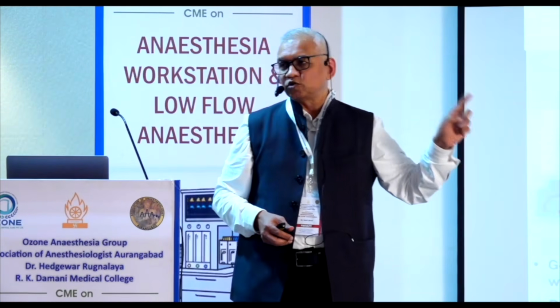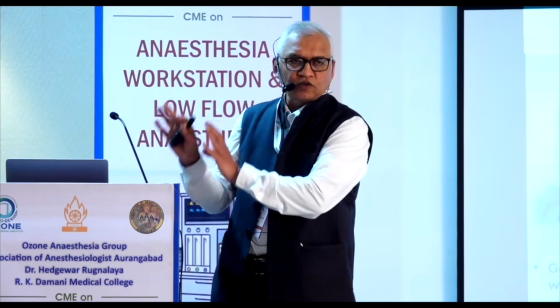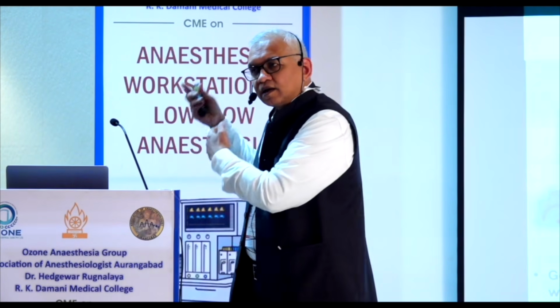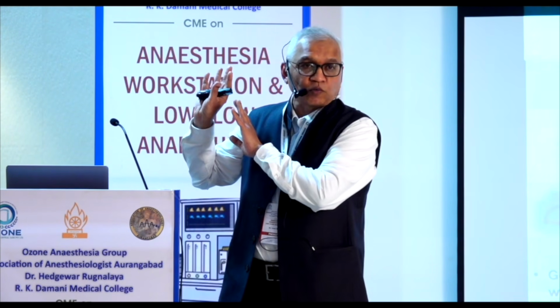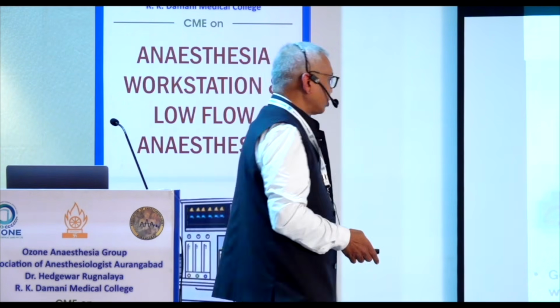In most situations, that is oxygen. Some machines give air as an option, but most companies do not give you that option. The oxygen is used to squeeze the bellows, and then it gets out into the atmosphere, which is not used. So the operation theater atmosphere is enriched with oxygen, because every time that 400-500 ml tidal volume is used, it is released into the OT atmosphere.